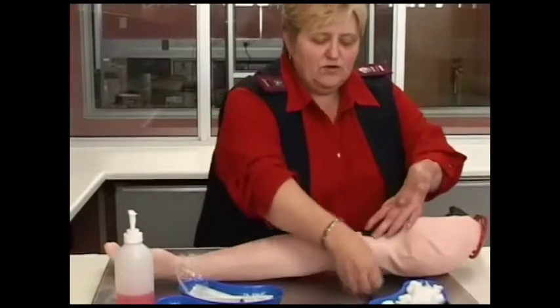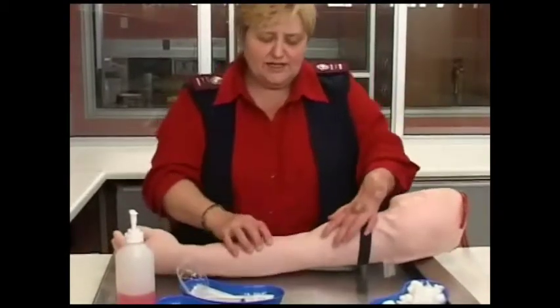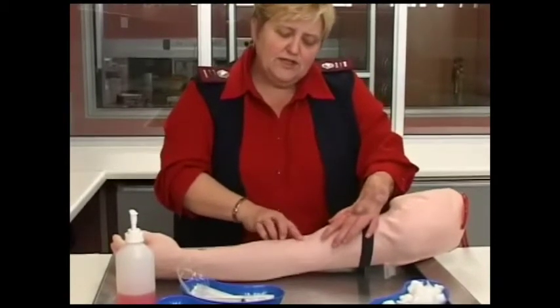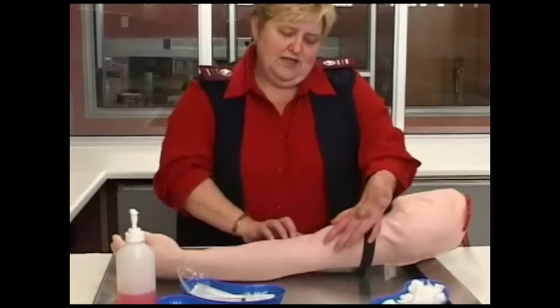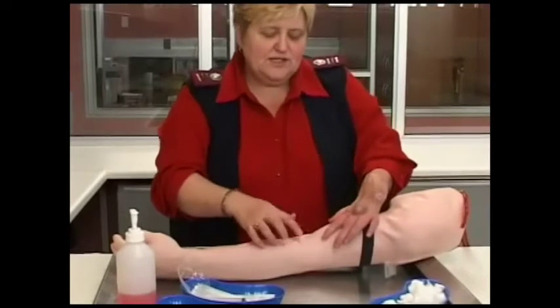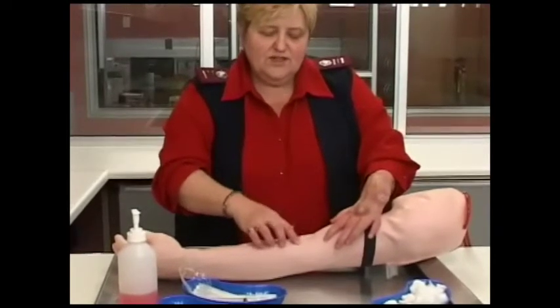Now you will fasten your tourniquet and select your vein. You identify the place where you want to take the blood and decide which vein you are going to use. That one is a very nice one — there is also a very nice vein to use there.